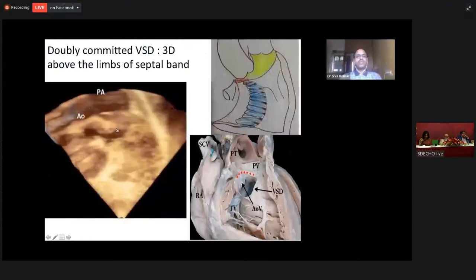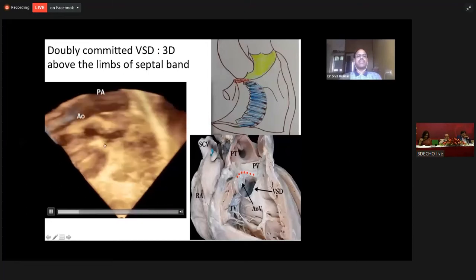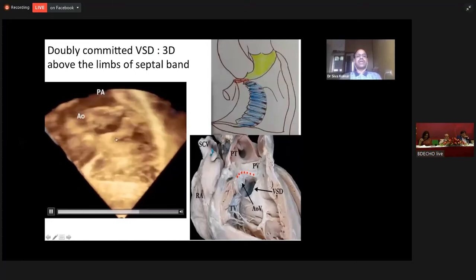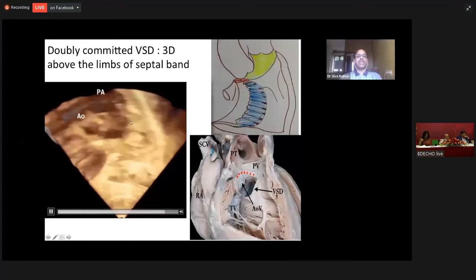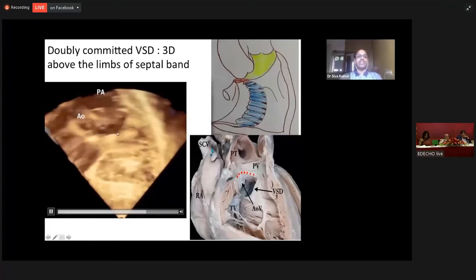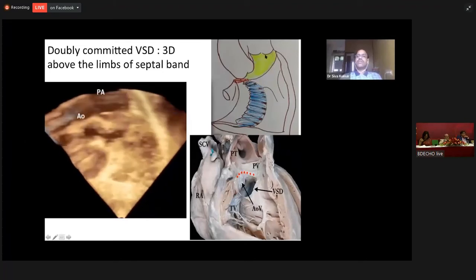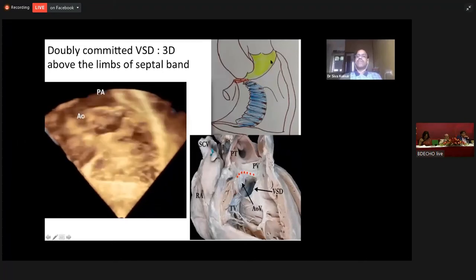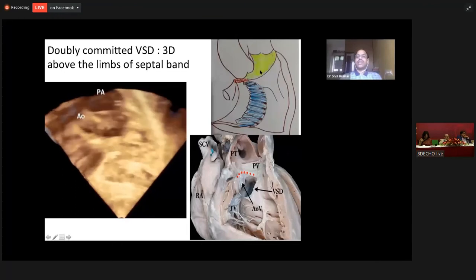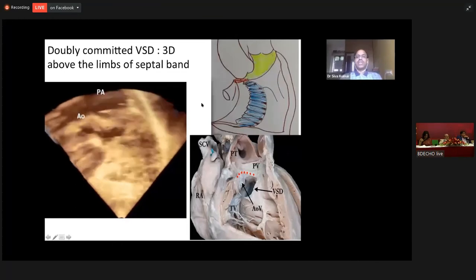And this is the three-dimensional en-face view. You can see the inlet septum is intact, the muscular septum is intact, the membranous septum is intact — a large sub-pulmonic outlet VSD which is located both below the aortic valve and pulmonary valve. So this is also called a doubly committed VSD — a large doubly committed VSD. You can see the large outlet septum, and this VSD is occupying the entire outlet septum.